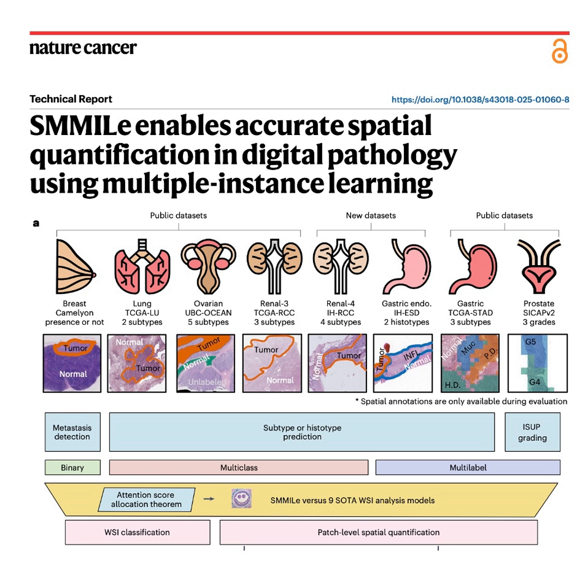Exactly. So to understand how it pulls off this cartography trick, we have to look at how AI currently processes these massive images. Because like I said, a single WSI can contain billions of pixels. Right. You can't just feed the whole thing into a standard neural network. The computer's memory would instantly crash. This is too much data. Way too much. So researchers rely on a mathematical paradigm called multiple instance learning, or MIL.